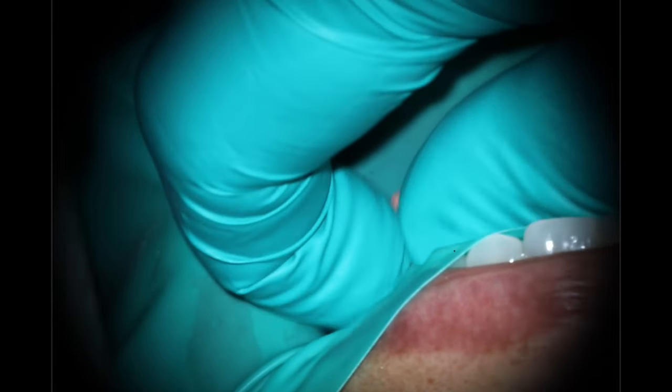Hand filing does not make for very good YouTube videos, so I'm going to try to talk through it. You can see we are still short of where I want to be — estimated length is about 20 for both the buccals. Distal buccal was 19.5 and still having issues. So what we're going to do is run through a series of files to try to open this up. I'm going to use C-plus files — for your board question, that is the difference between a C-plus and a regular C file. C-plus files are sharp at the tip, whereas every other file is blunted, and they are a 0.03 taper instead of 0.02 — a little bit stiffer, you can put more pressure on them.